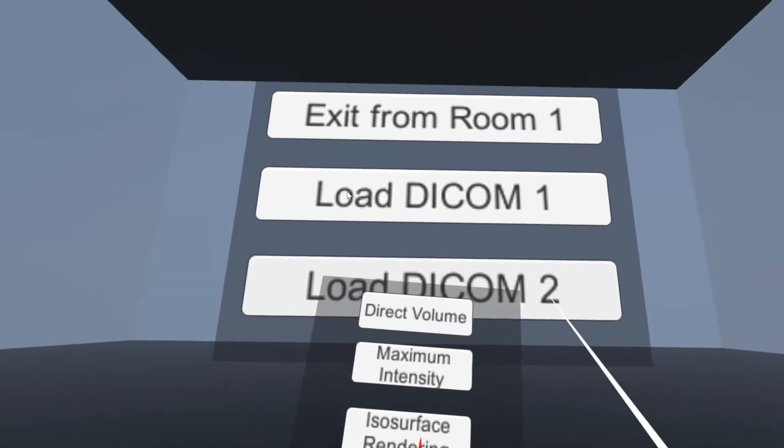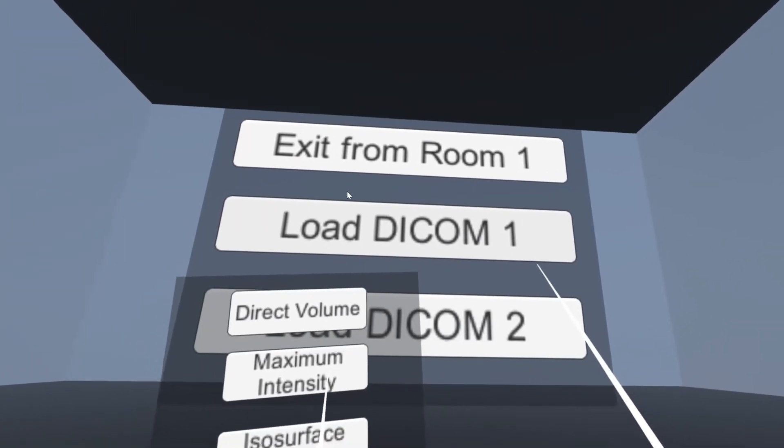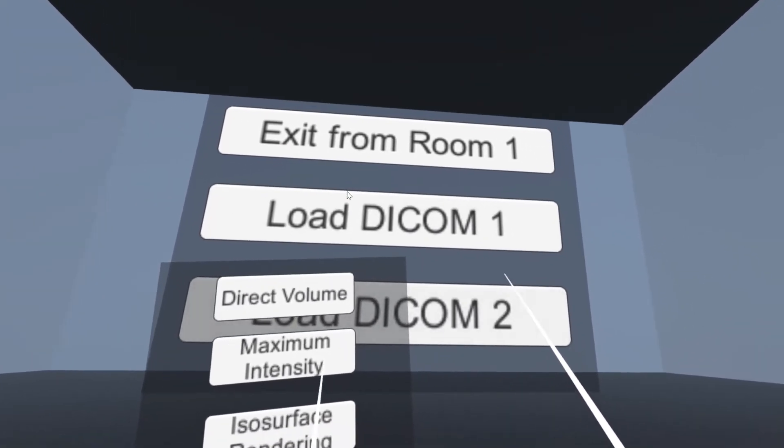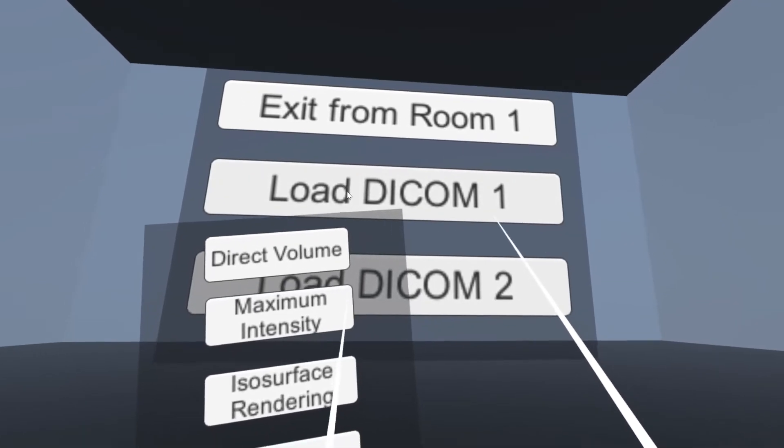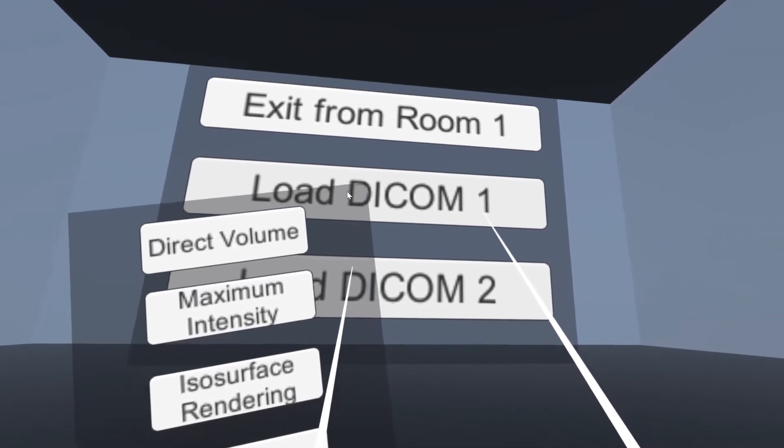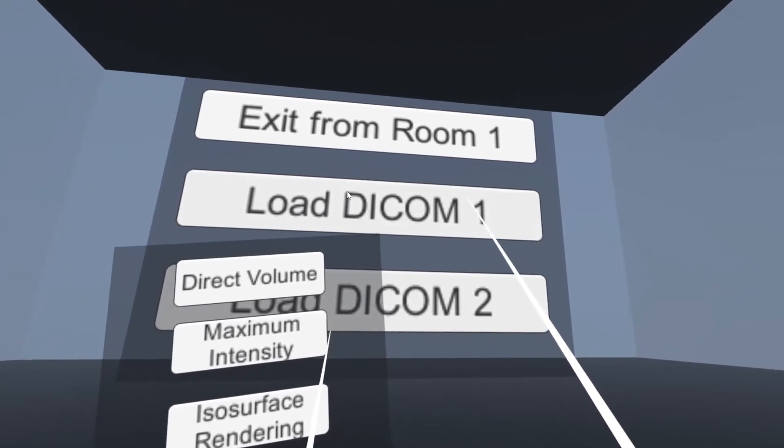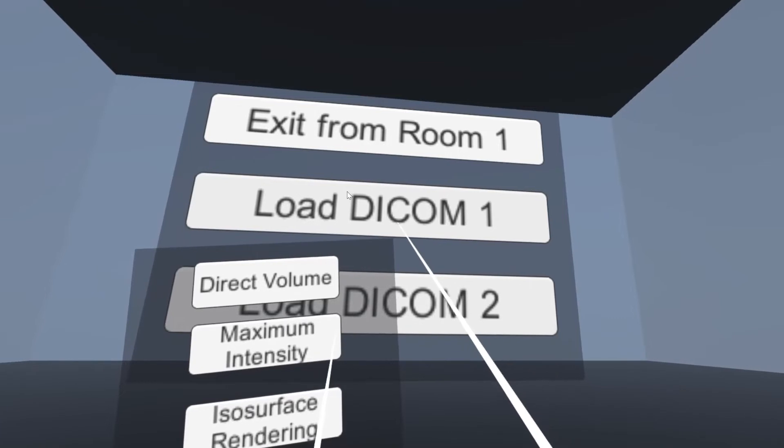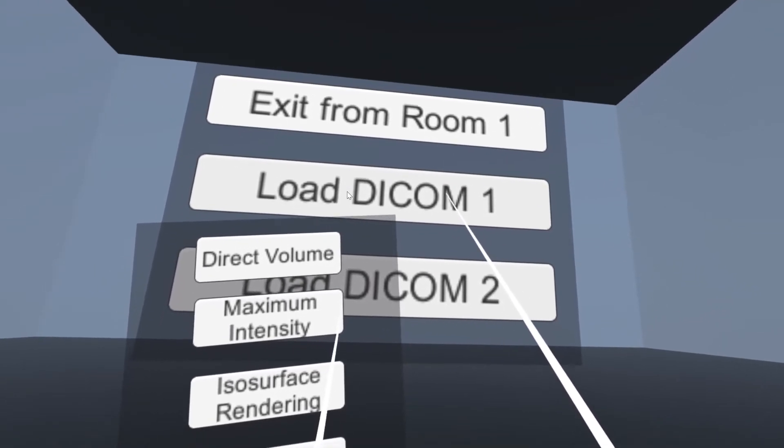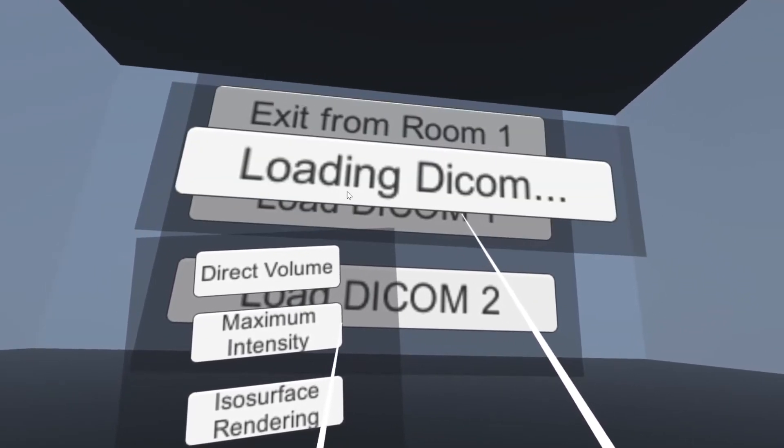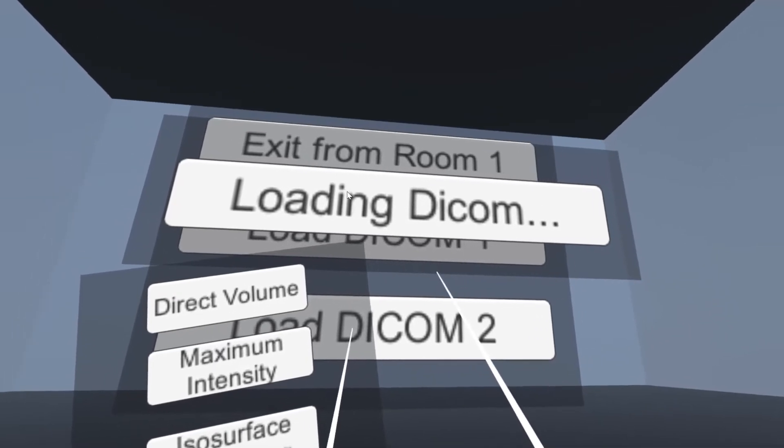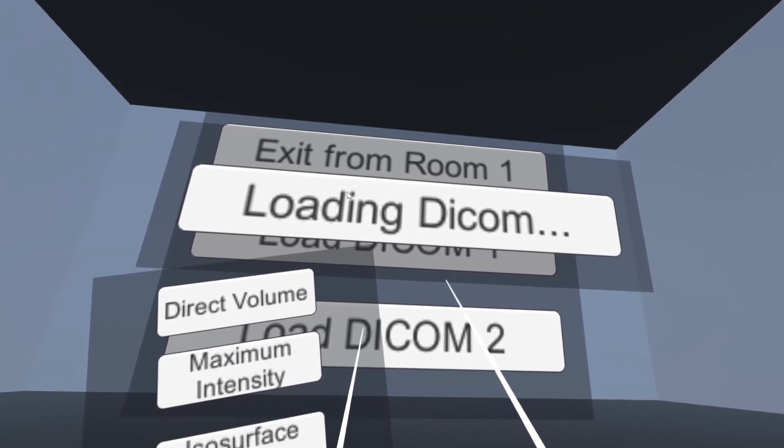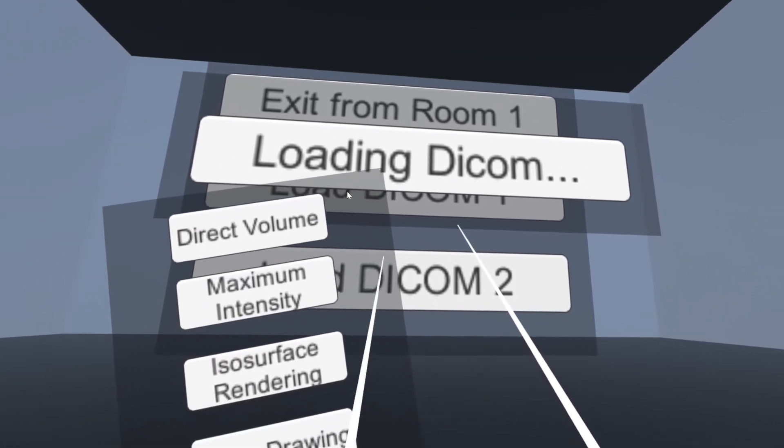In each room, doctors are then able to use the DICOM files that they uploaded in the previous step and render it in view of the patient. We'll load the DICOM 1 that we uploaded before. This will take a while, so I'm going to skip straight into after it has rendered.